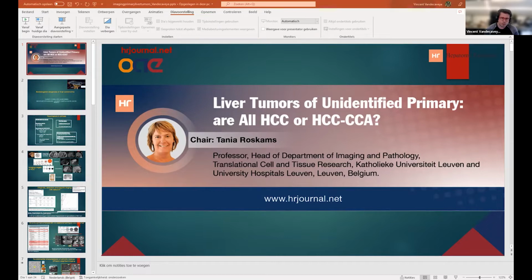Of course, arterioportal shunts are easily differentiated because of their morphology. But still, these are the lesions to avoid false positives. But these are not lesions that we are likely to biopsy. In hepatocellular carcinoma, often the question is, can we reach the lesion and is it not too dangerous for the patient? Because of course, these are a lot of patients with comorbidity, cirrhosis.